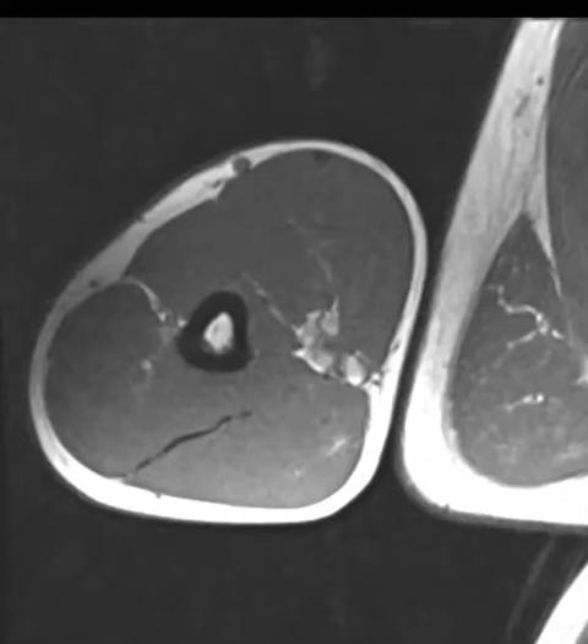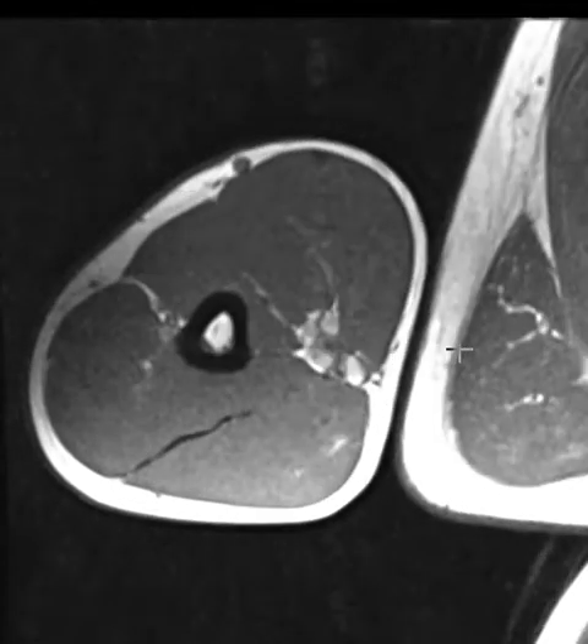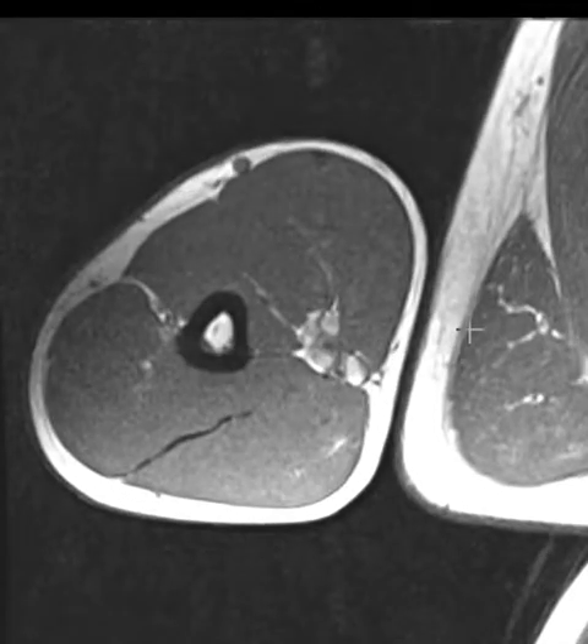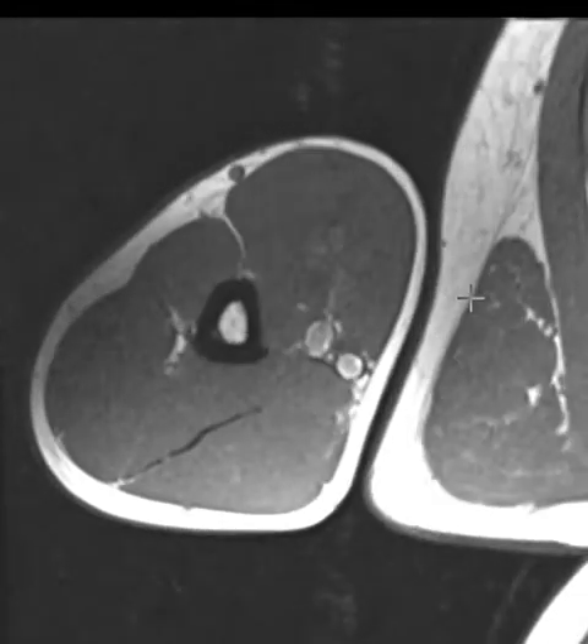Hello, this is Dr. Gay from First Lake MRI. This is a 44-year-old male with complaints of right arm weakness for the past week or so. It's in the back of the arm — the triceps area. He does work out and has been working out pretty hard for the past six months, but has done nothing unusual recently. He also has some weakness in the thumb and index finger over the past week as well.